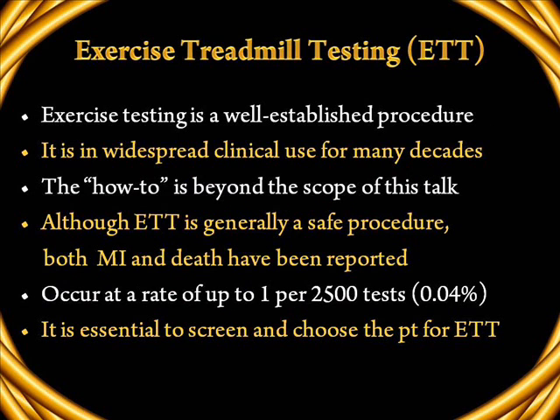Exercise testing is a well-established procedure. It is widely available everywhere and it is in clinical use for many decades. But of course, this lecture is not going to focus on how to do this test in great detail. Although ETT is generally a very safe procedure, there are instances where we end up with some complications like a myocardial infarction or sometimes even fatal outcomes like death are reported. However, these are quite rare.